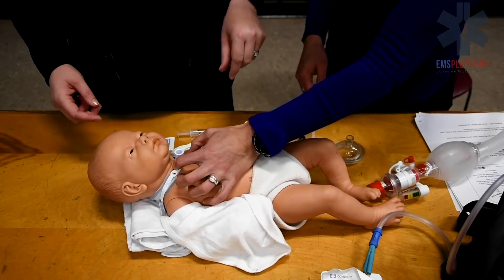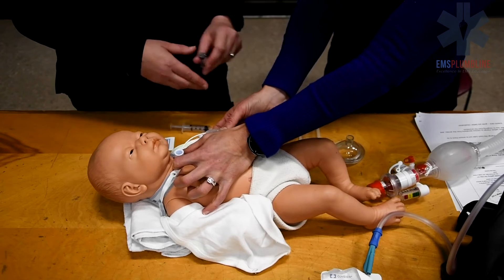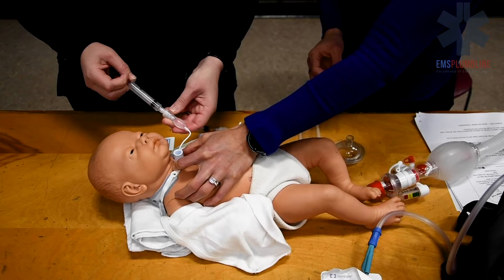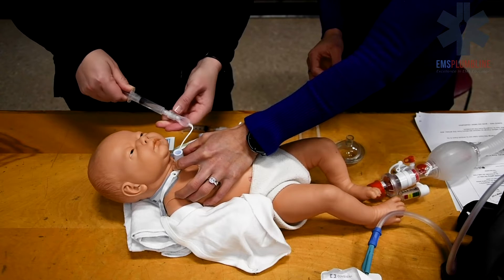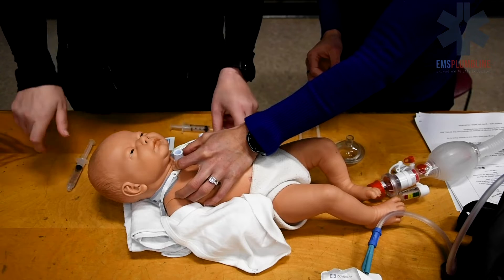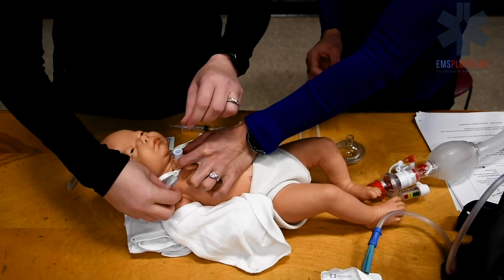Now it is time to change the trach tube. Have one person keep the trach tube stable in the patient. Deflate the trach cuff as applicable. Remove one side of the old trach ties.